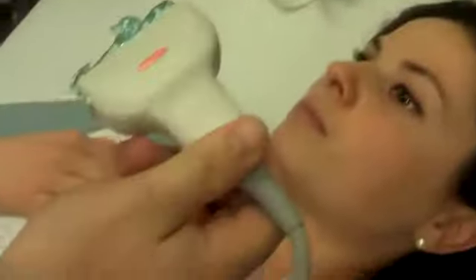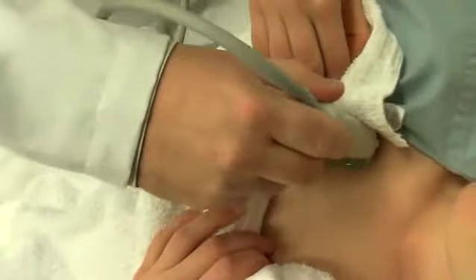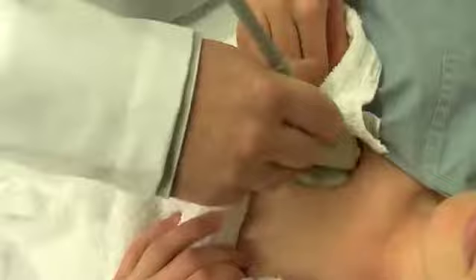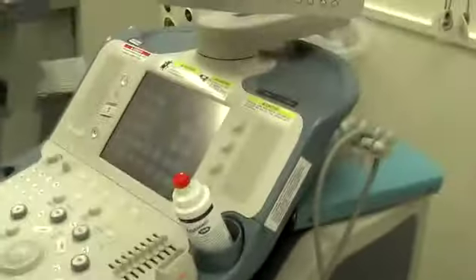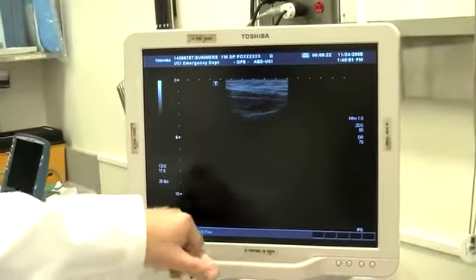I'm going to start out here by going to the patient's head, and I'm going to put it just in the second, third, and fourth intercostal space, just on the chest. Probably midclavicular line. So my picture here, this is all wasted real estate. I'm imaging 10 centimeters deep, which is unnecessary, and it's leading to poor image quality. So I'm going to change my depth again.